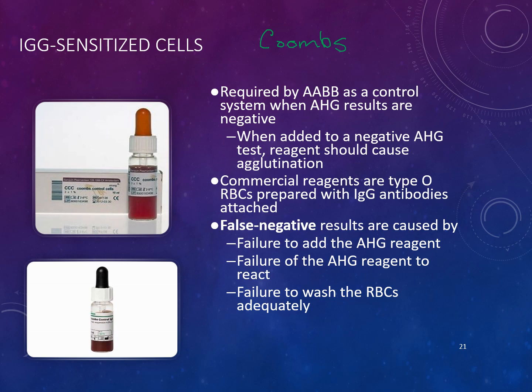So you will often hear some physicians still refer to a DAT as a Coombs test. Coombs is not really a test, it's actually a dead man. Coombs refers to the man that developed this test methodology. And so you sometimes refer to check cells or Coombs control cells. But what I'm trying to get at with this is we saw that a lot of false negatives can happen with that particular test method.